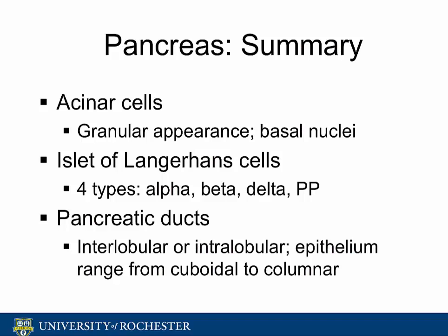In review, pancreas histology may be divided into acini, islets, and ducts. Acinar cells make up the majority of the pancreatic lobules and are densely packed with organelles and basal nuclei. There are four types of islet cells, but they are essentially indistinguishable through H and E staining. The pancreatic ducts are lined by epithelium which varies from cuboidal to columnar. This concludes our review of normal pancreatic histology.